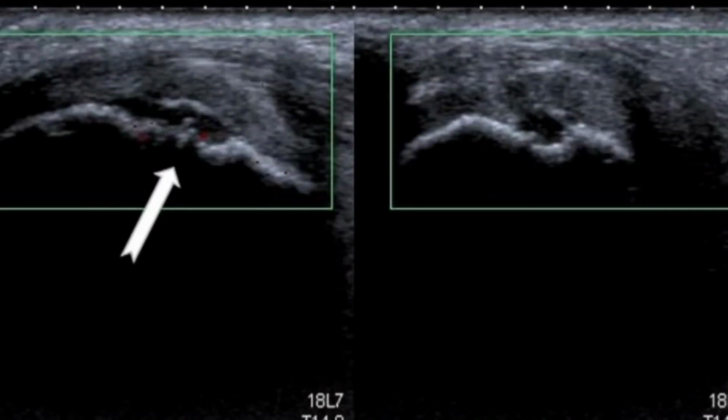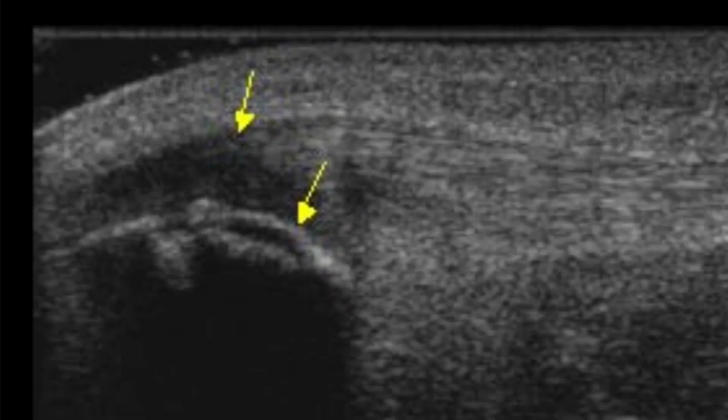Here is another ultrasound view. You need a high resolution probe, and you have to apply a lot of gel and, without any compression, put the probe on the angle of the inferior patellar margin where the patellar tendon attaches. This is quite easy and convenient for those doing physiotherapy. If you have the equipment, you can straight away confirm Sinding Larsen Johnson disease in your clinic, and also Osgood-Schlatter disease, because the findings are only changes in the patellar tendon's fibrillar pattern. There will be ossification and also fragmentation of the bone where the tendon attaches.